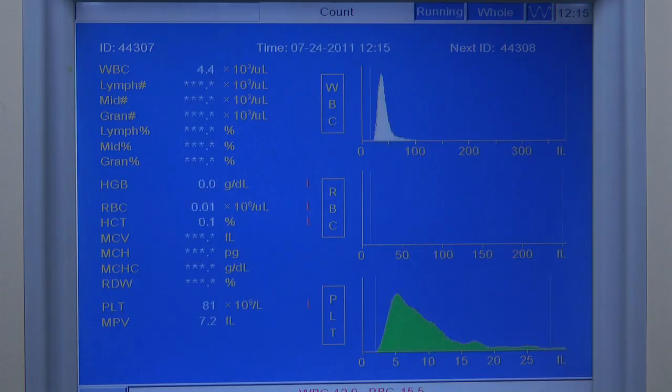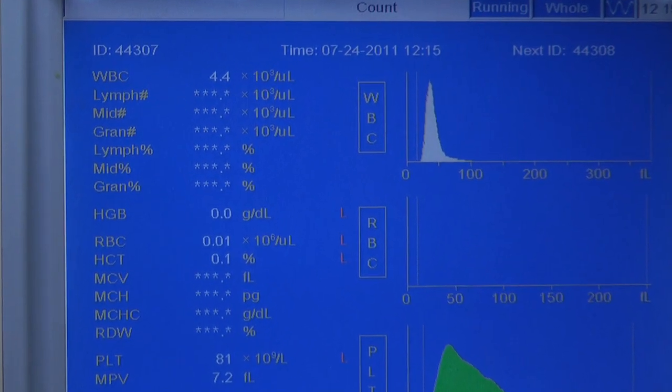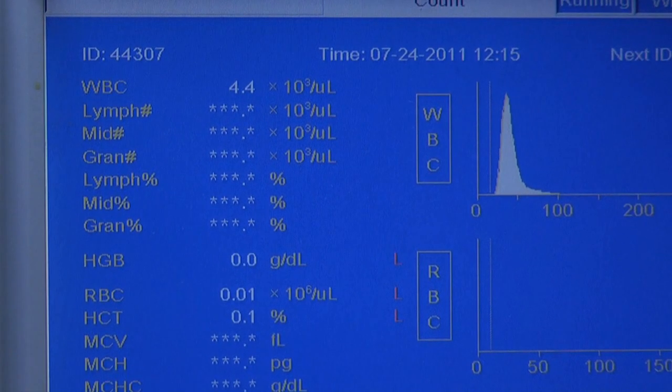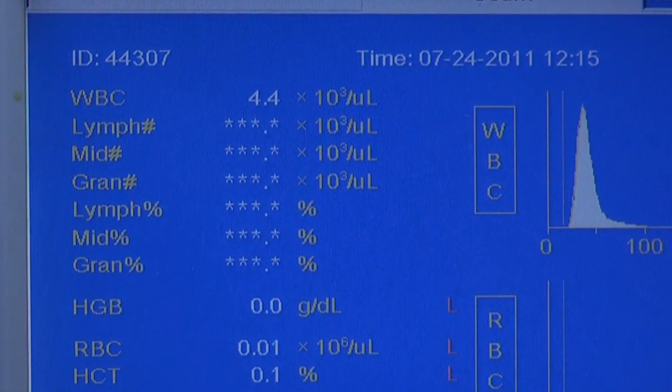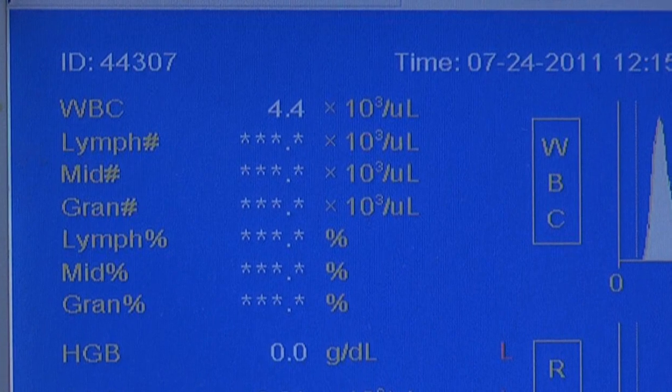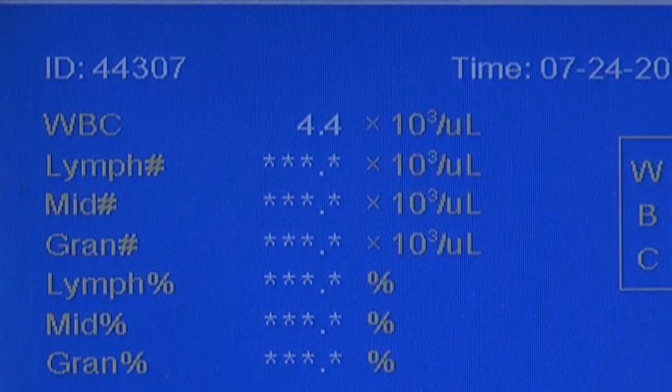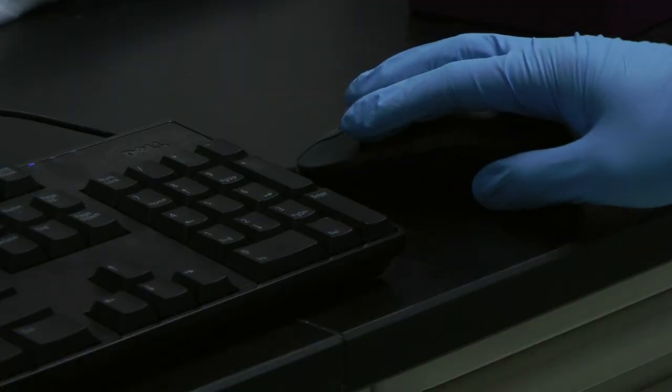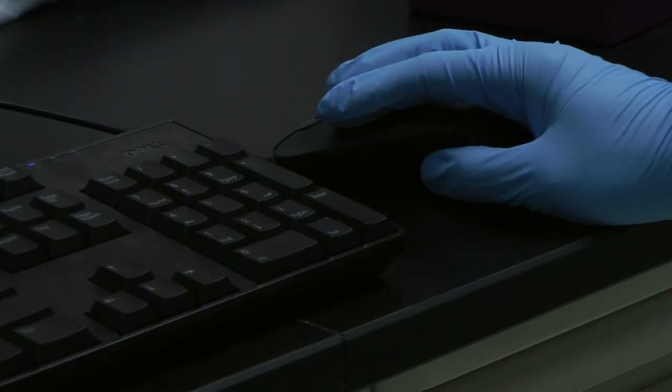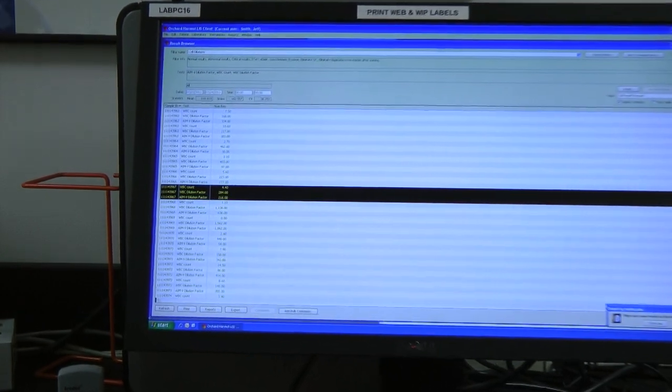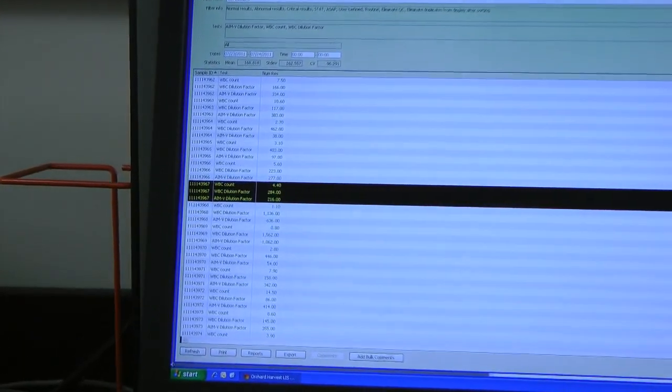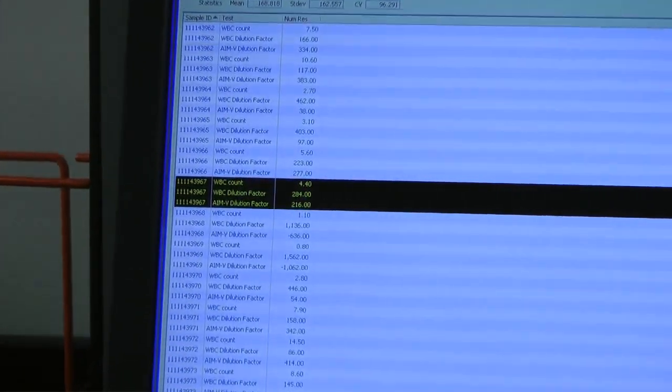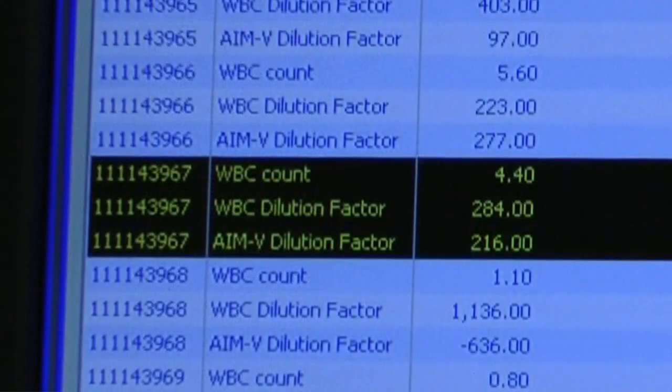Once the PBMC count is available, a 500 microliter final cell suspension must be prepared at a concentration of 2.5 times 10 to the fifth cells per 100 microliters. A formula is built into the laboratory information system such that based on the PBMC count, the laboratory information system calculates the amount of PBMCs and AIM-V cell culture media necessary to prepare a final cell suspension.